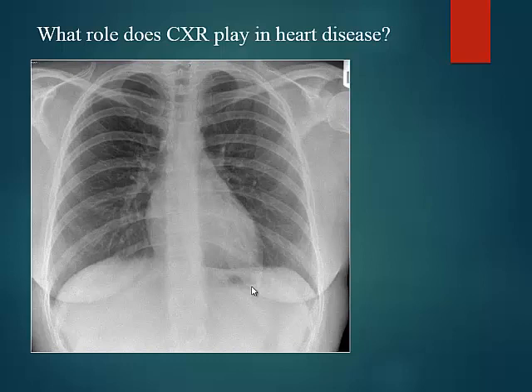So chest pain, which chest pain? Any chest pain, generally you probably want to do a chest X-ray as a baseline. Chest X-ray can be used to exclude certain things. It may not give you a diagnosis of chest pain, but it may be helpful. Okay, so anything else?